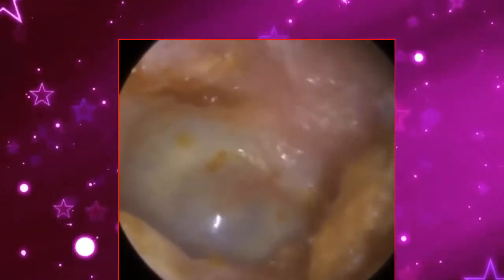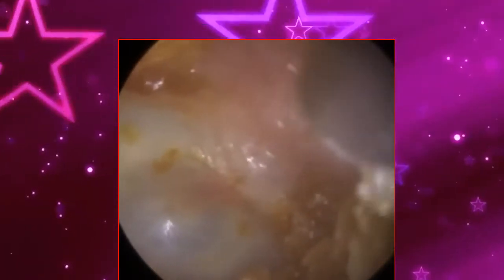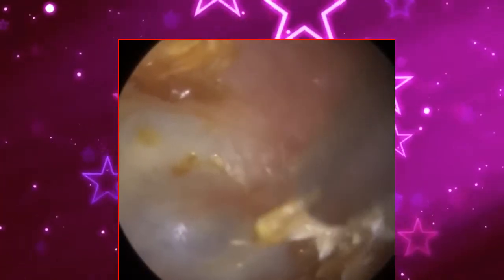So there's the eardrum. It is visible. There is a light reflex. You can see the reflection of the light coming off the eardrum, kind of near the centre to the bottom slightly. That's always a good indicator of a healthy eardrum. Not always. Eardrum slightly opaque, slightly white. This was an elderly patient. They generally have more opaque eardrums. It's just they're exposed to more acoustic vibrations over the years, so they do get a bit of scar tissue developing.